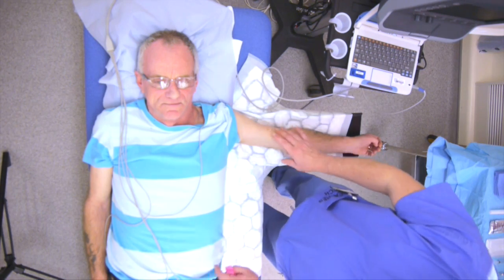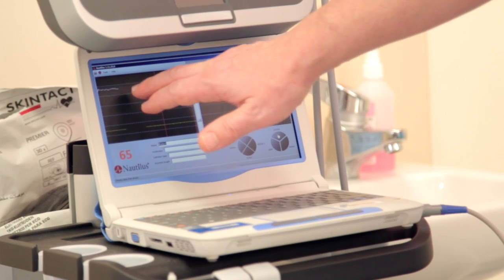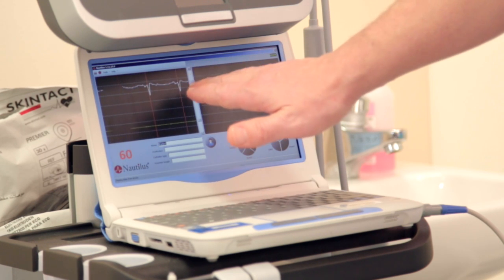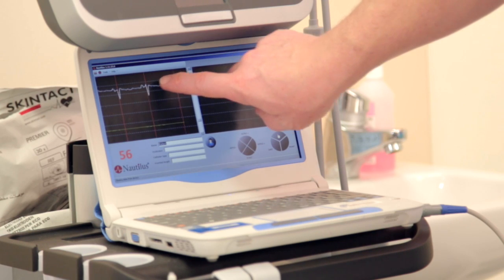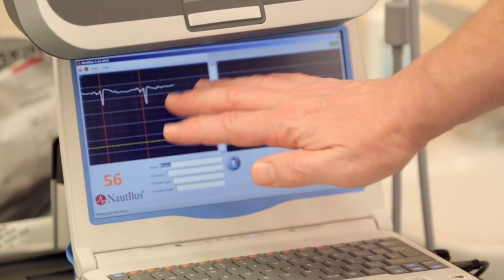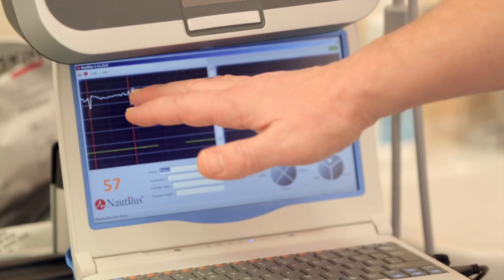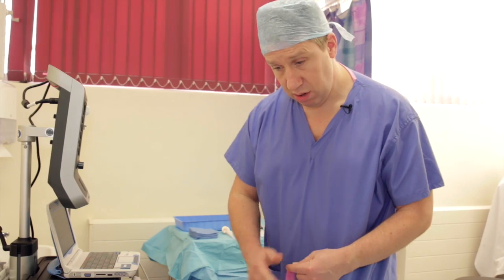We now have the surface ECG connected — the yellow, green, and black leads — and we have a nice surface ECG trace. You'll notice that the QRS complex is inverted from the traditional positive view, but that's not a problem. What we're interested in is the P wave, and we can see clearly that the patient has good P waves before each QRS complex. The ECG is quite slow because the patient is taking bisoprolol to slow the heart rate.